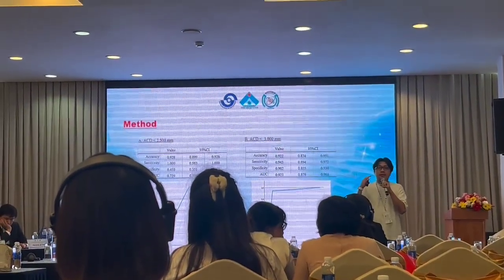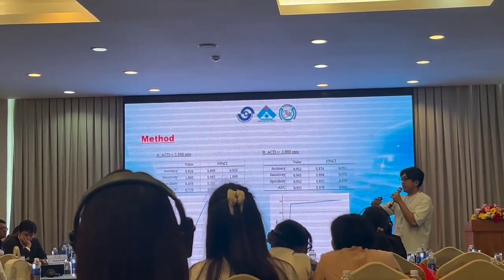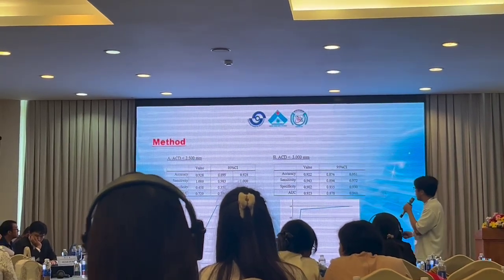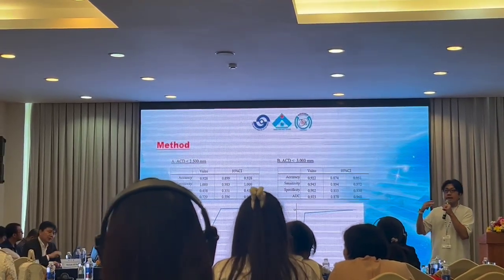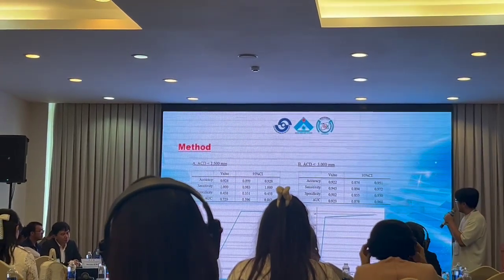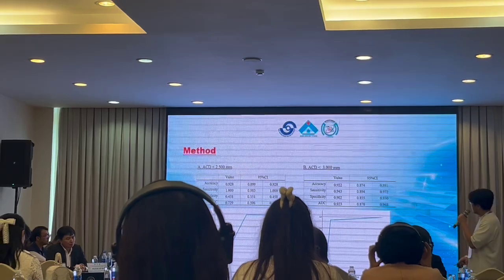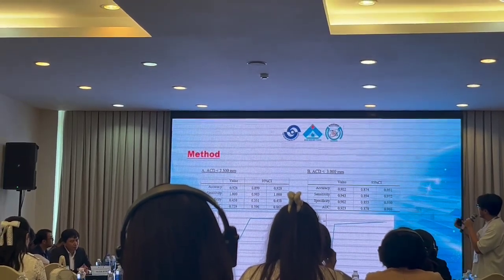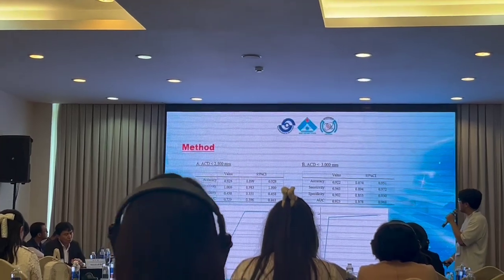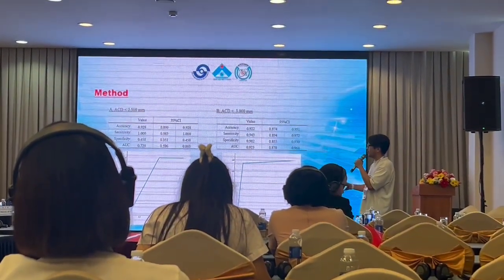When we divide all the frames by the cutoff value of ACD, 2.5 or 3.0, which is the value to see the risk of acute angle closure, we can see that if the cutoff value is 2.5, this model can achieve a sensitivity of 100% and specificity of 45%.